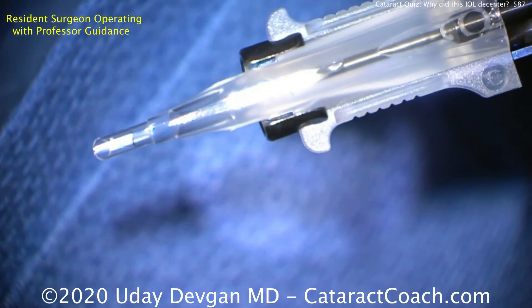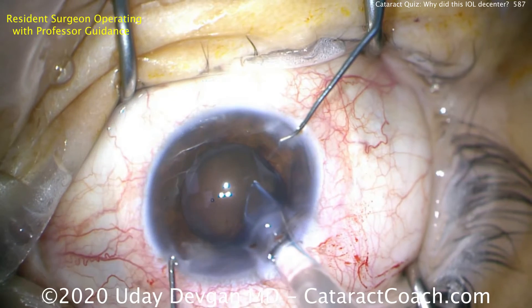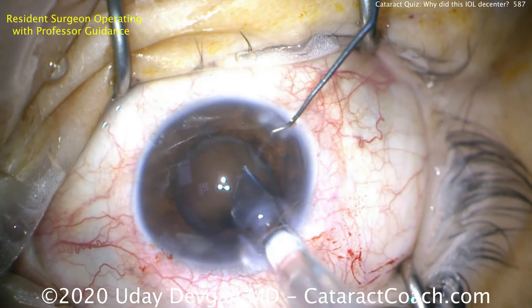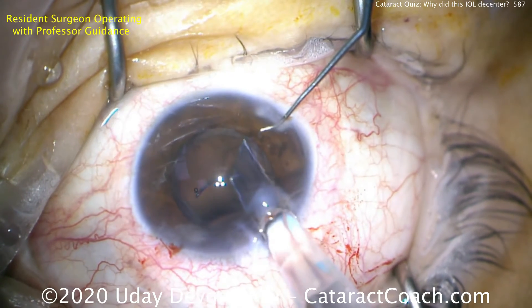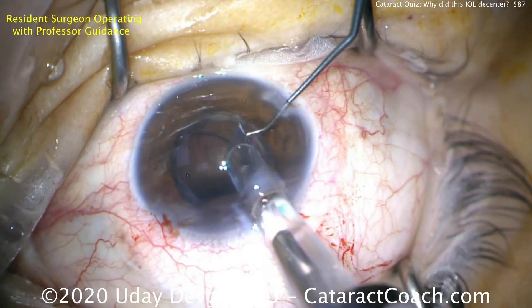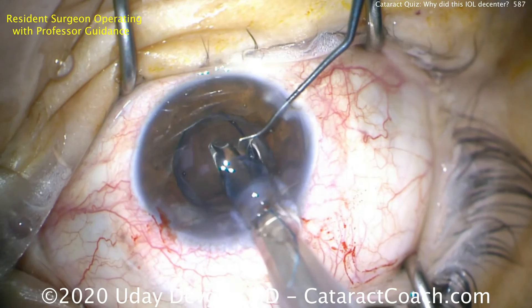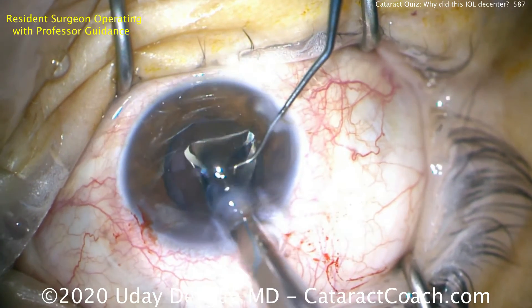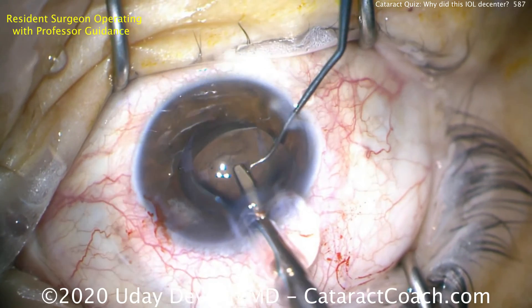That looks great. Now we'll deliver this lens in the eye. If you deliver a lens during routine surgery and you notice the lens is severely damaged — like loss of a haptic — don't continue; explant that lens. It's not going to stay centered. You need to have both haptics on these lenses. So now delivering the lens inside the eye — there's one haptic, there comes the optic, and here's the trailing haptic. We'll make sure this goes completely in the capsular bag.